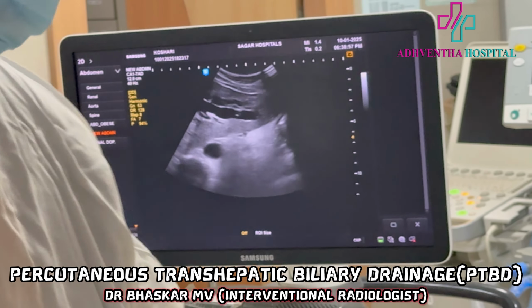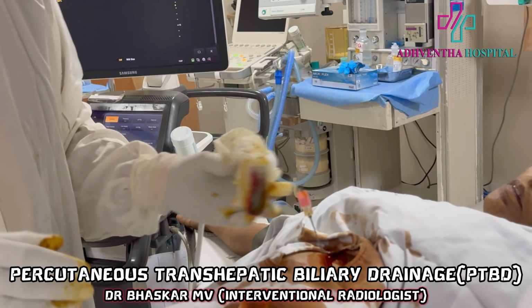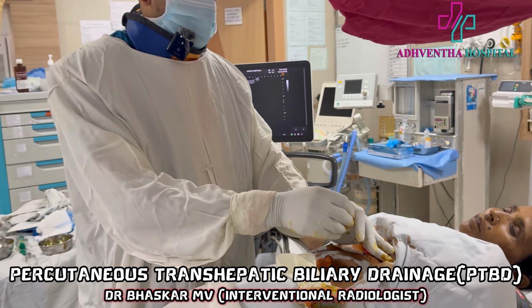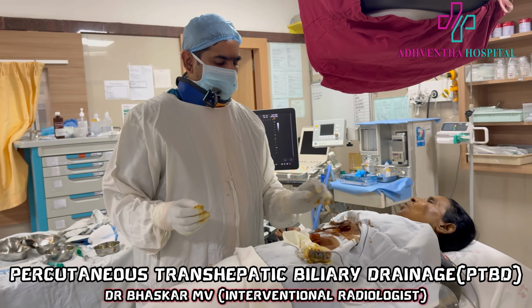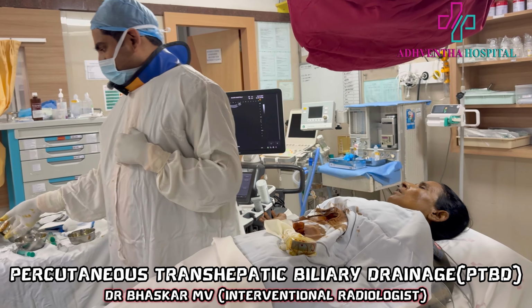After puncturing that, how will you confirm it's bile or not? You should get a honey colored bile if it is non-infected. If it is stagnant for long, you will get a greenish one. Can you see honey colored? Just like honey. So that is non-infected.